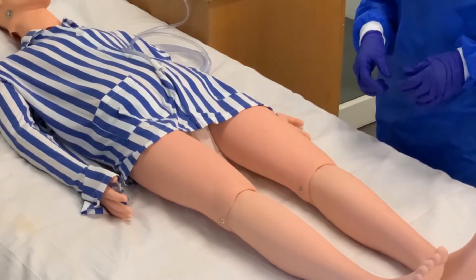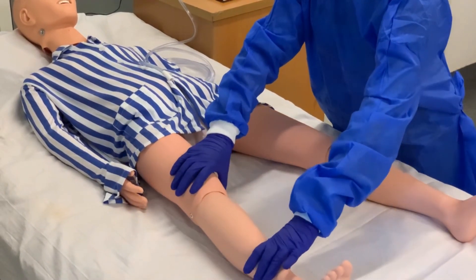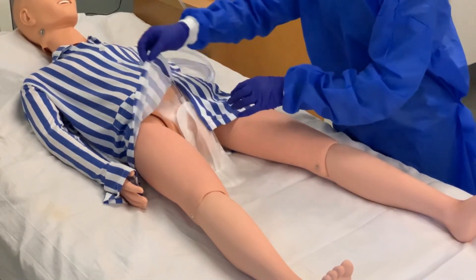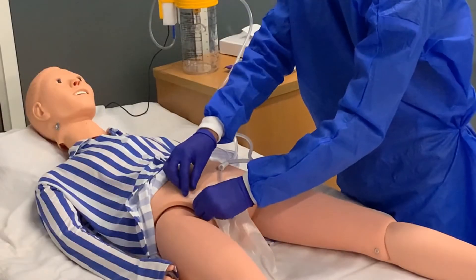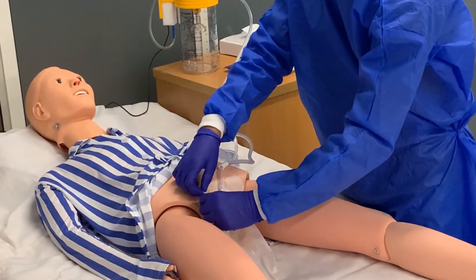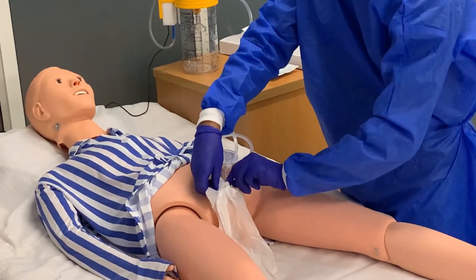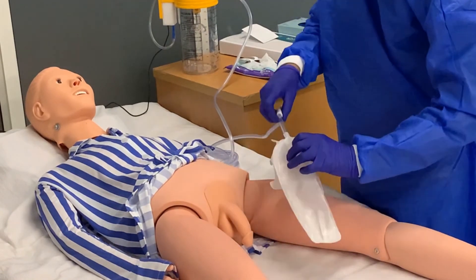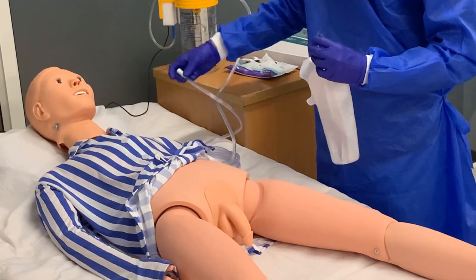To remove the device, position the patient in the supine position with their legs slightly apart. Position yourself such that the urogenital region is clearly visible and easily accessible. Starting from one end, gently remove the entire adhesive patch from the suprapubic region and carefully retract the shaft from the pouch lumen. Disconnect suction tubing and discard the device according to institutional protocol.